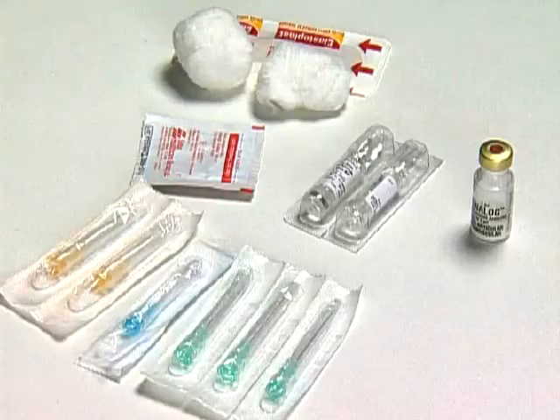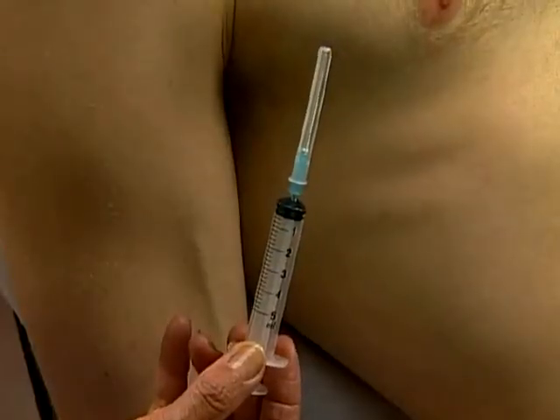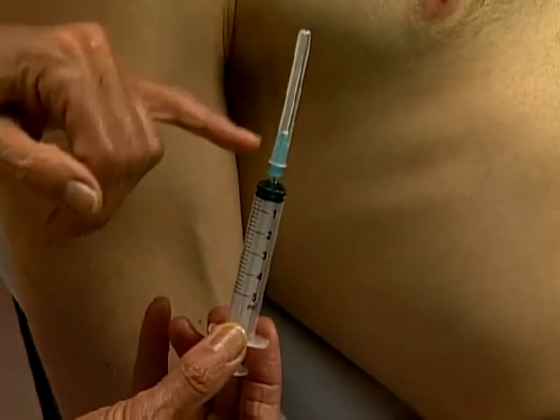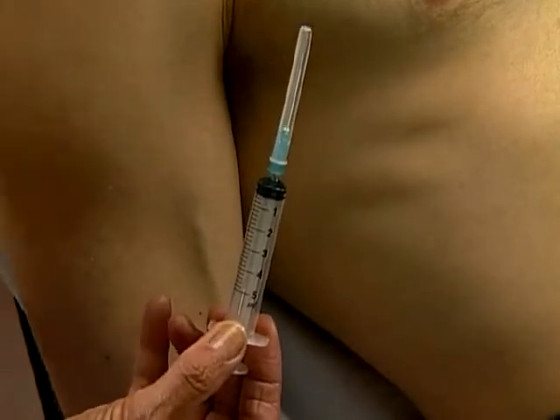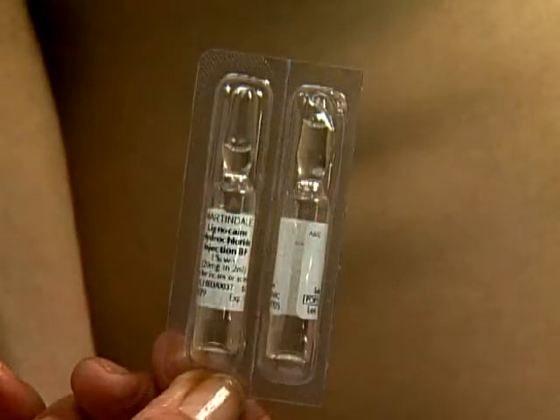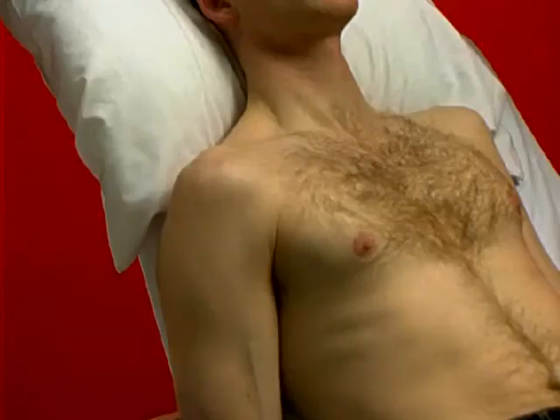Assemble sterile wipes, cotton wool and plaster. Prepare a 5 ml syringe, a drawing up needle and a 23 or 21 gauge 1 1/4 or 1 1/2 inch needle. Select a 1 ml vial of a medium-acting corticosteroid. In this case, Kenalog 40 is used. And 2 ampules of 1% local anaesthetic, lidocaine in this instance. Check drug names, doses and expiry dates.